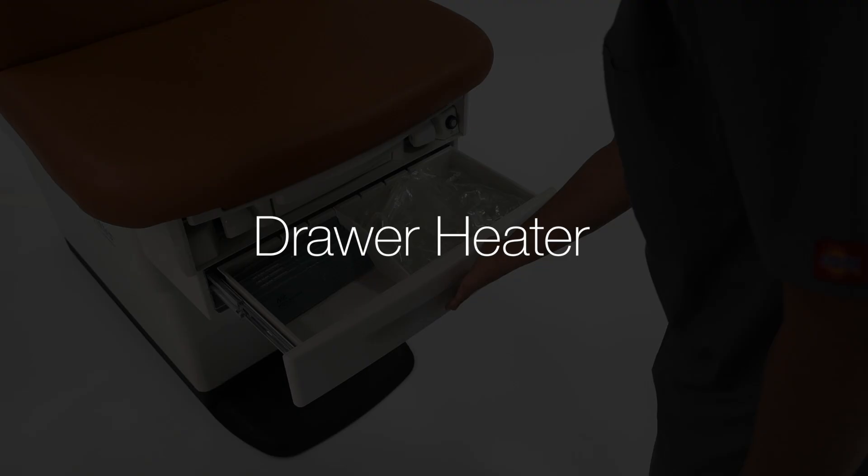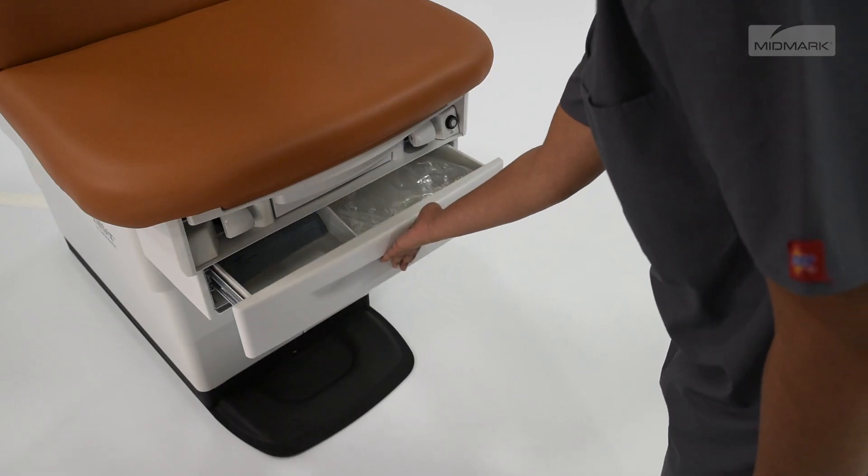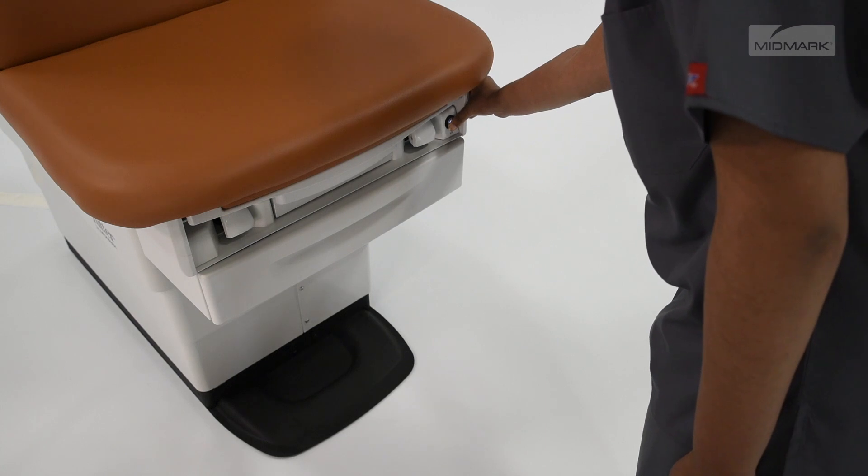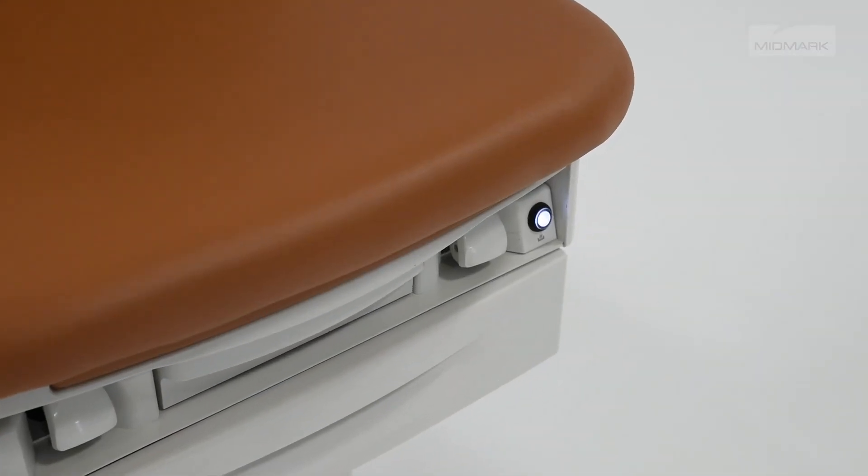The drawer heater warms the contents of the drawer to approximate body temperature. To turn the drawer heater on or off, press and release the drawer heater switch on the chair. The switch will illuminate when the heater is on.